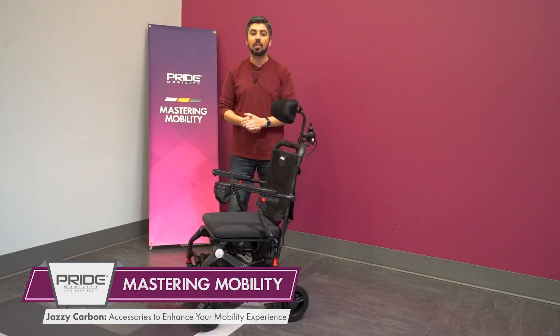Well now, Pride Mobility is introducing three new optional accessories to the Jazzy Carbon, which are taking this power wheelchair to the next level.